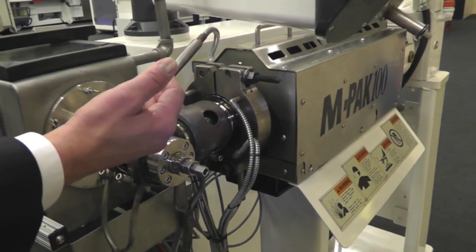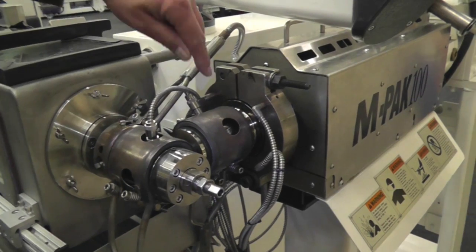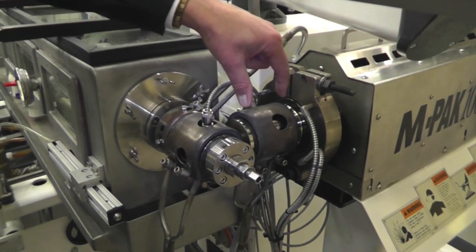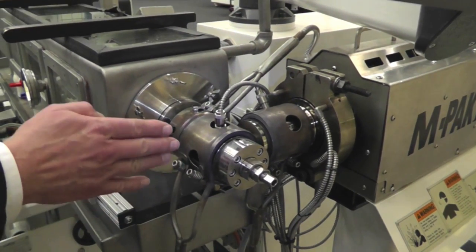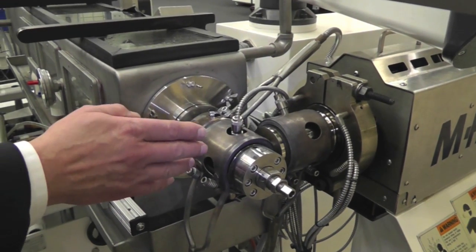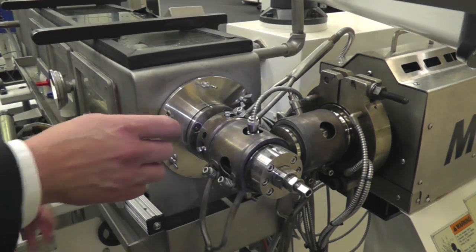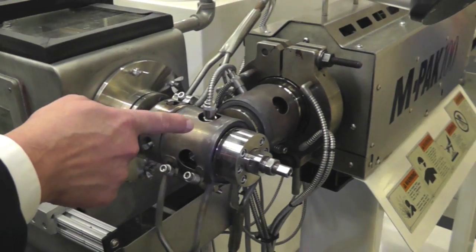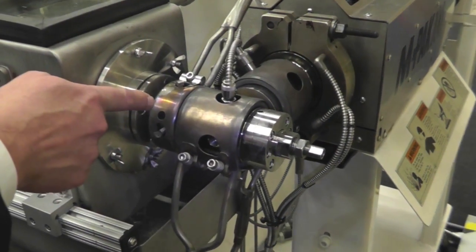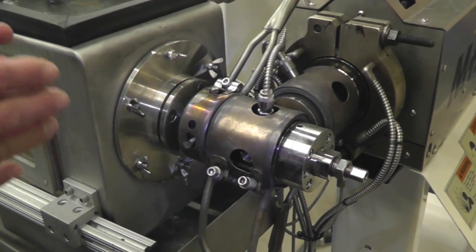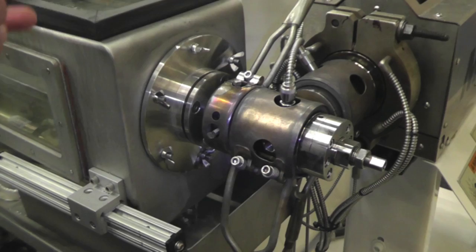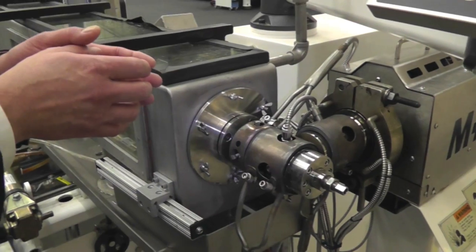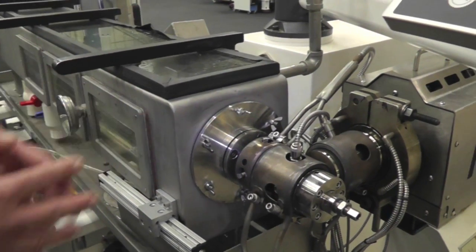We come out to the exit end of the extruder into what we call cross tooling, where the melt flow is going to come in. It's going to go into the cross head where there's tooling which will change that material flow from this direction to the inline direction. Inside we have a tip and a die. The tip forms the inside of the tube, the die forms the outside of the tube, and then it exits into the tank.